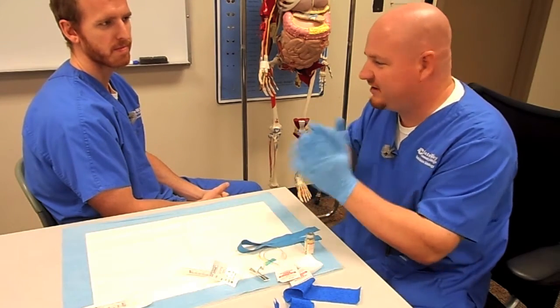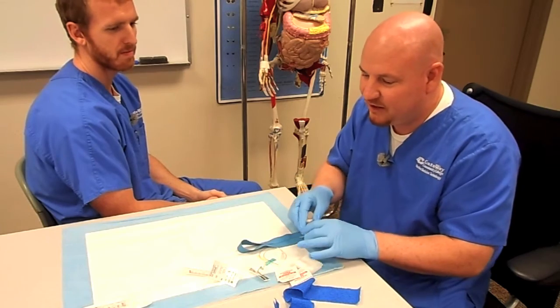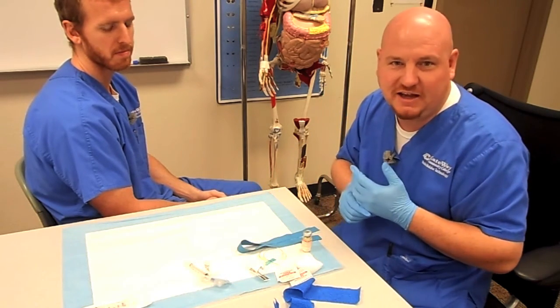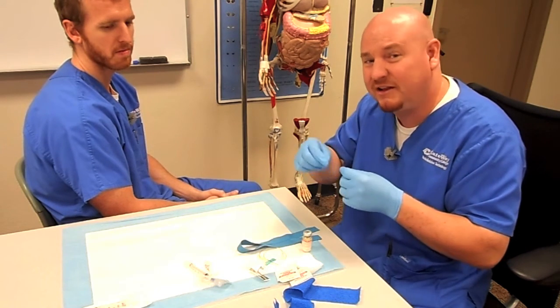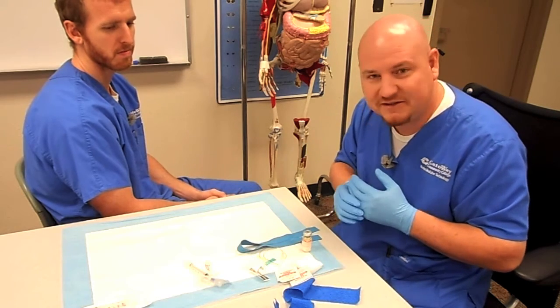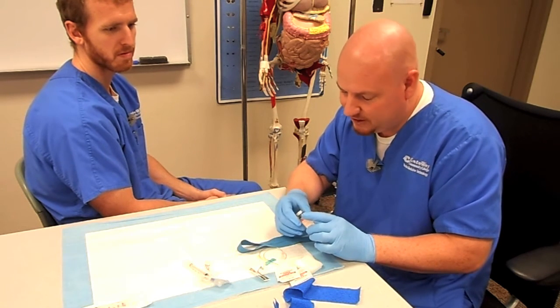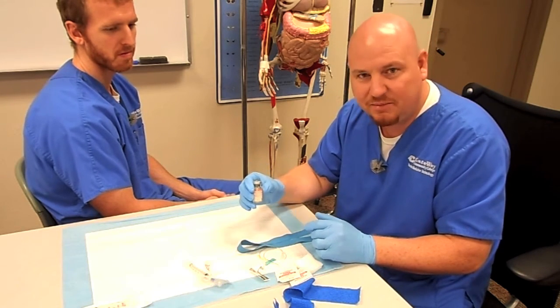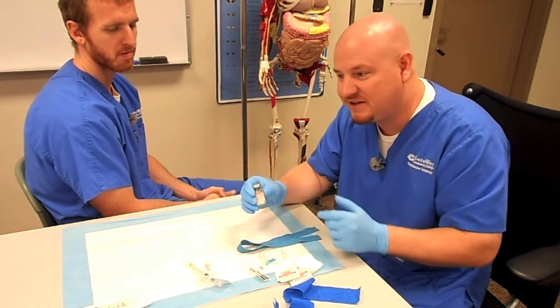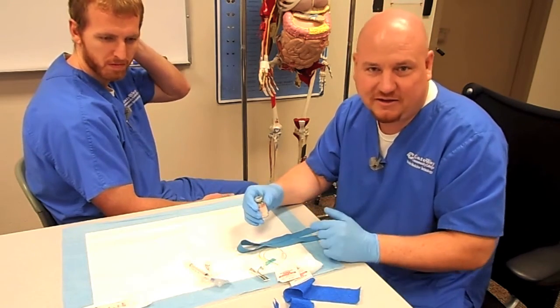For the first part of this, I've already identified my patient and gone through all the prep. It's going to be the blood draw. Once you draw the blood, you need to use a syringe that has a little bit of anticoagulant in it — either ACD or heparin. With ACD it's a maximum of 0.15 milliliters per milliliter of blood, and with heparin it's recommended 10 to 15 units — just a small amount. Your clinical advisor will be able to show you how exactly they do that at your site. I like to take the reaction vial with me so that as soon as I draw the blood I can put it into the reaction vial. You need to let it wait for five minutes to give the stannous ions time to diffuse into the red blood cells. By taking this with you, you can get that five minutes started while you're taking the elevator back down to the hot lab — it's just a little more efficient.